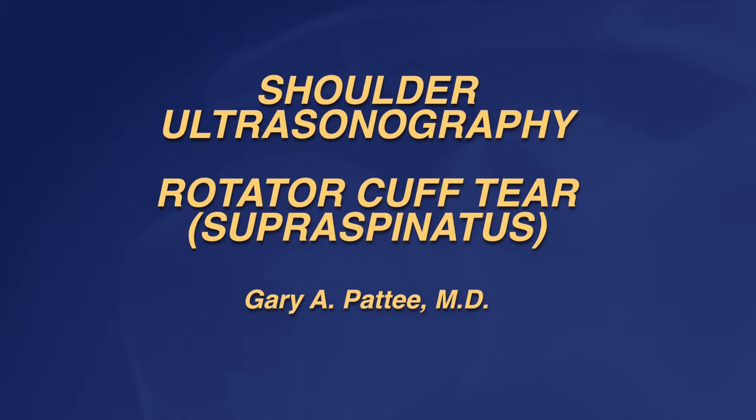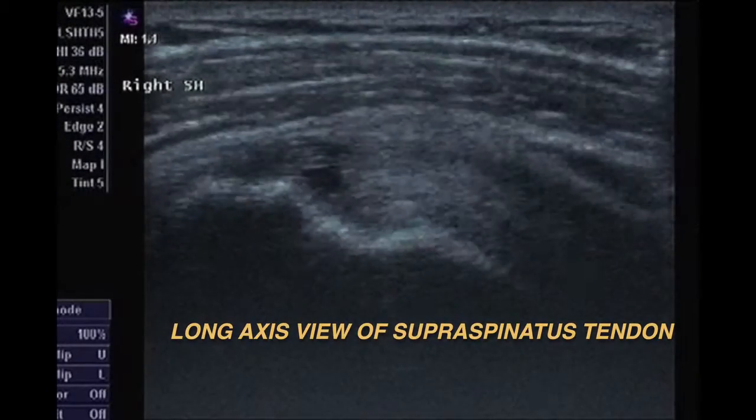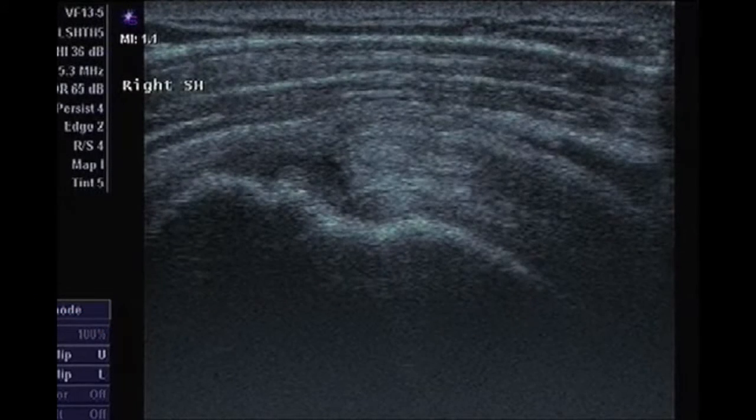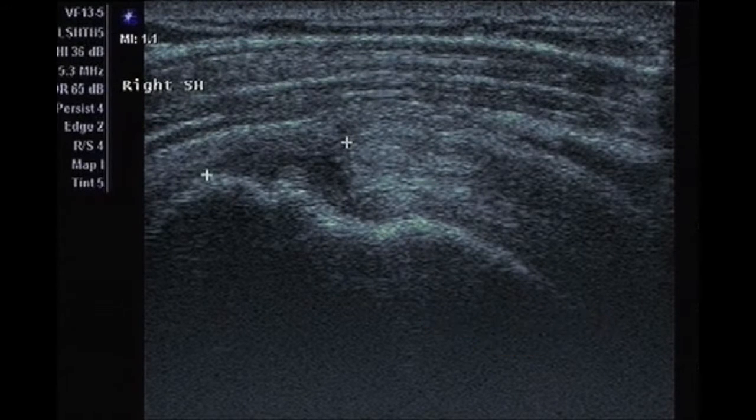This is an ultrasonographic view of a full thickness rotator cuff tear, in this case the supraspinatus tendon. This is a long axis view of the tendon. On the left side you'll see the greater tuberosity and the center is the humeral head. Over the tuberosity there's a hypoechoic area, and that's the full thickness rotator cuff tear. This measures 14 millimeters in the long axis.